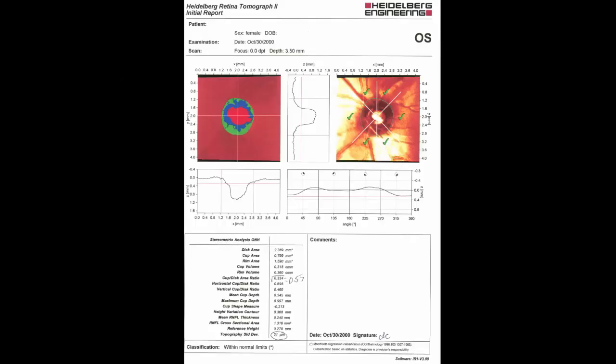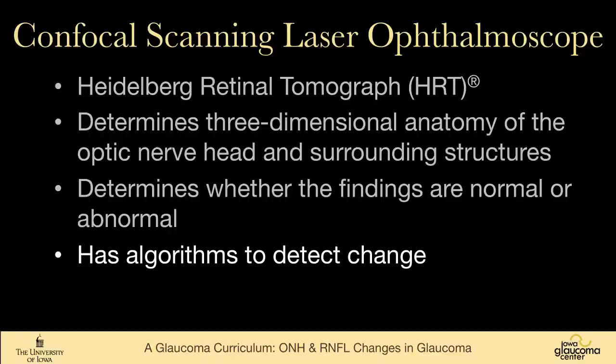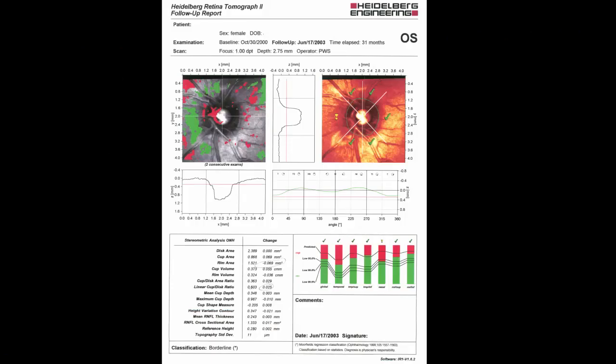This is an HRT of a patient of mine showing that the nerve is fairly normal, large cup. It'll give us at the bottom here the disc area, cup area, rim area, cup volume, lots of other parameters about the anatomy of the optic nerve. And it has algorithms to detect change. So this is somebody who has had 2 exams separated by 31 months, and you can see areas of improvement and areas that are changed. There's a suggestion here that this part of the optic nerve is thinner.